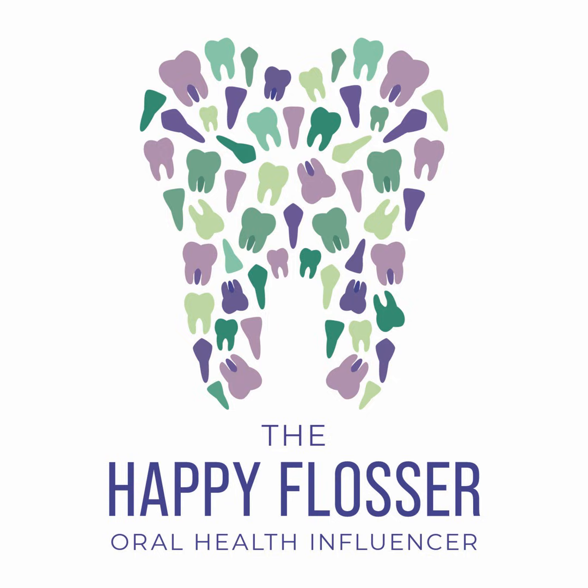There are some things that you can do to be best prepared to see your patient that will help you manage the patient better. Offer those encouraging words and have a positive attitude towards your patient. Be calm and self-assured. You can also provide the patient with small breaks between your images and offer encouraging words as you go. Taking the sensor out of their mouth to allow them a moment to just breathe and rest will go a long way at showing your compassion and kindness towards your patient.